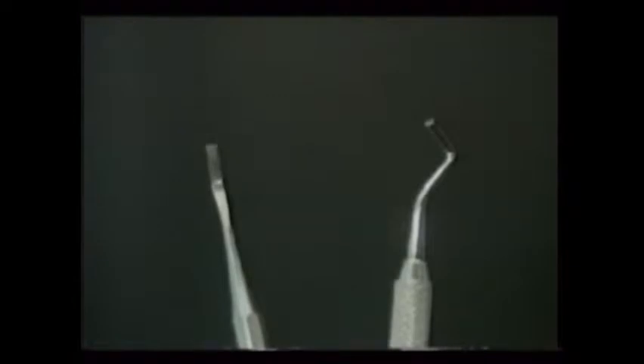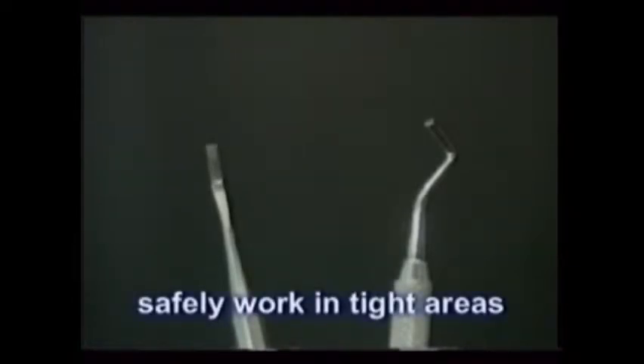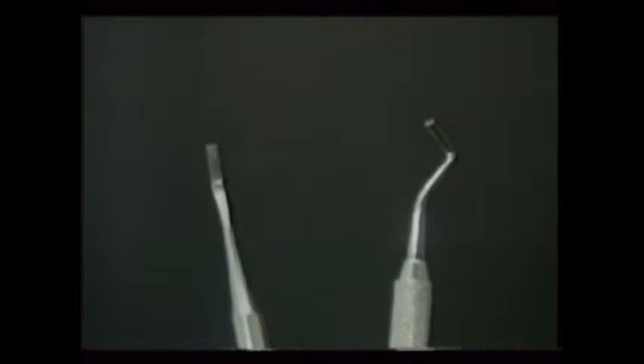Hoes, hatchets, chisels like those shown here — these can all safely cut and remove tight areas within the teeth, which is very important during some procedures like class II amalgams and inlays.